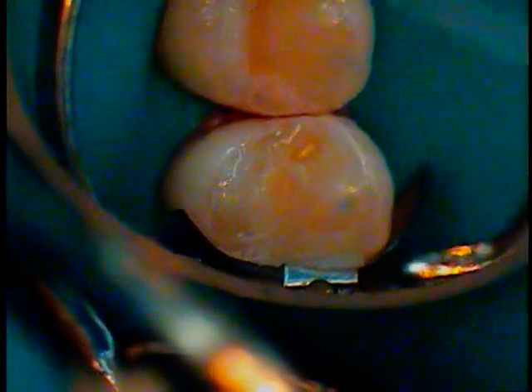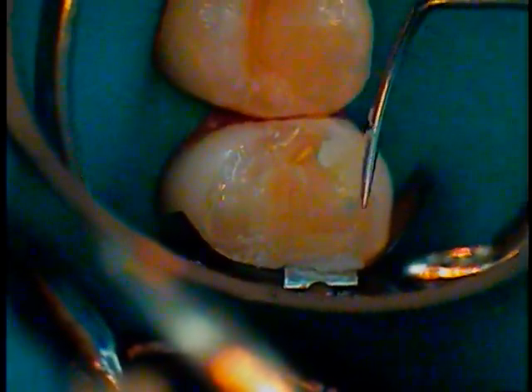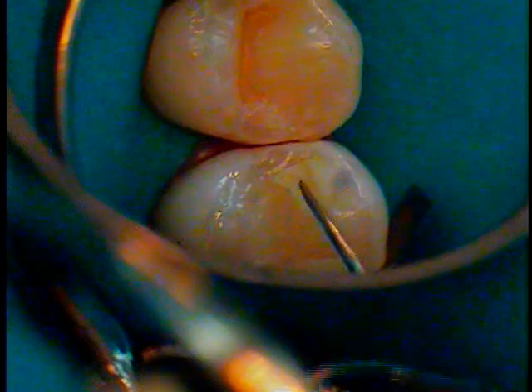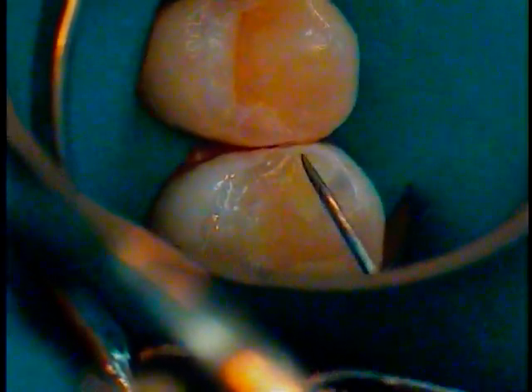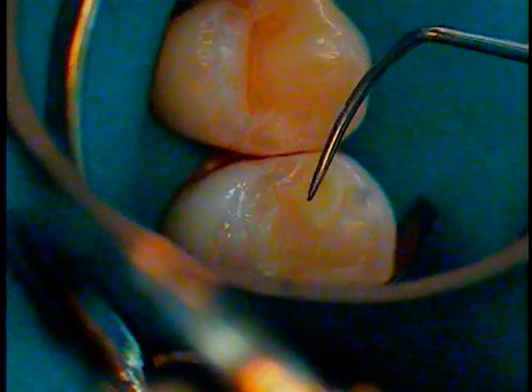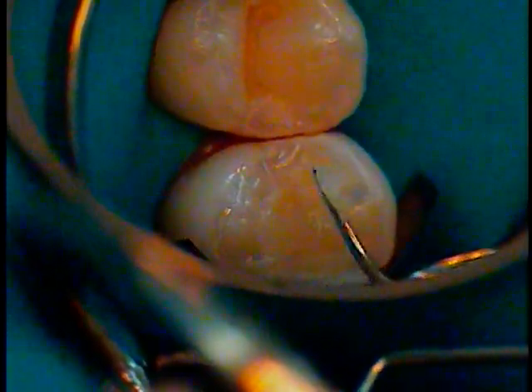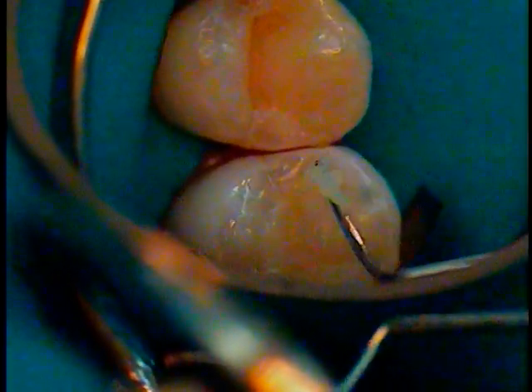Got a little bit of overbuild up here. And I don't know what that is, but I'm going to fill that in. Transfer it. It's too much. It's hard to take off of this. There it goes. Just push it in there. It looks like a little dimple from where it's already been etched and primed. Okay. Not worried about the excess.